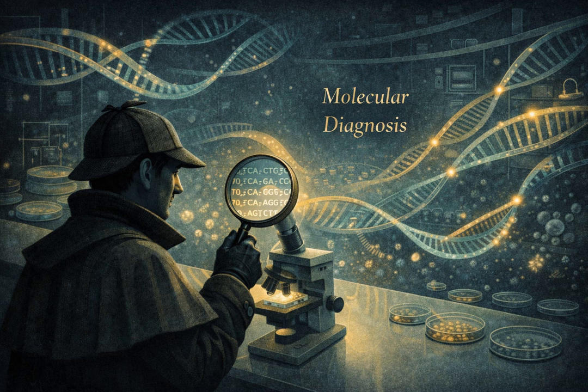So you don't even need a fancy fluorescence detector. You can just look at it. In some settings, yes. You can just hold the tube up to the light. If it's cloudy, it's positive. This makes it an amazing technology for low-resource settings, for point-of-care testing. It's used for rapid TB testing in areas without big, expensive labs. We also use it in hospital labs for things like C. difficile testing. Okay, so we've covered magnifying the signal with probes, and we've covered Xeroxing the signal with amplification.